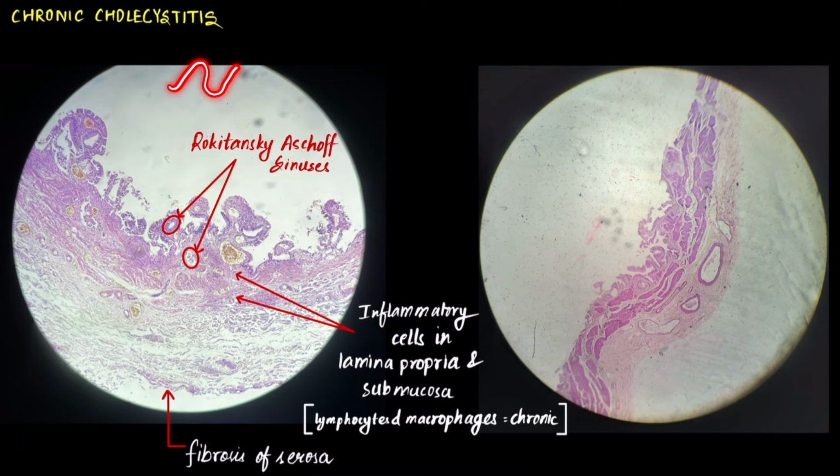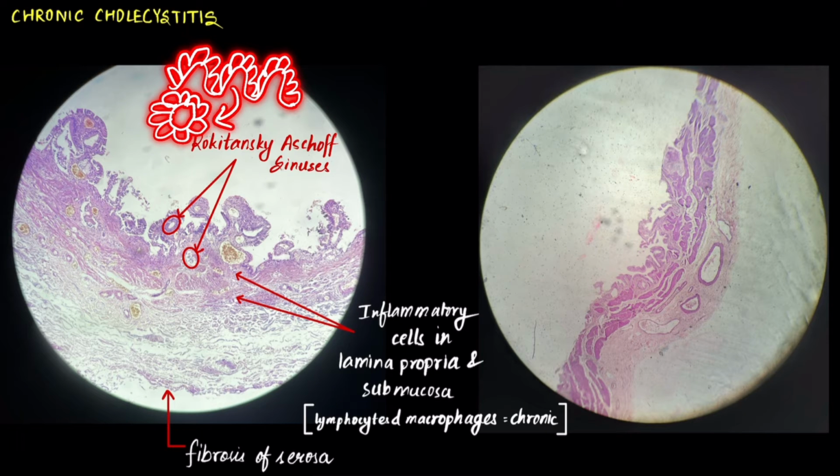See, so there's your epithelial mucosa, which is lined by epithelium. From this epithelial mucosa, outpouching takes place and a sinus comes off, which is lined by the same epithelium. So this comes from this epithelium or this mucosal layer. This sinus comes off.